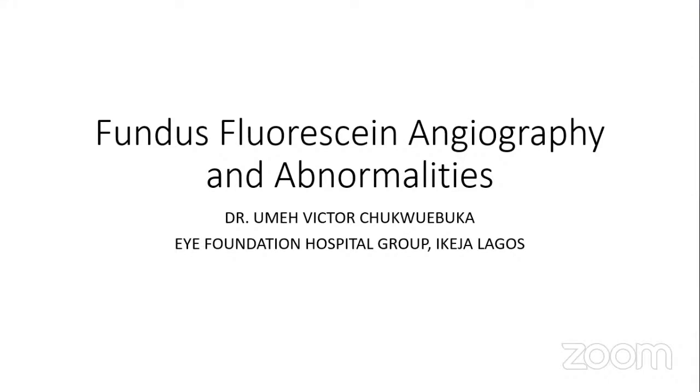This morning, we will do a short overview and proceed to tell us on hyperfluorescence and other abnormalities that can be found with doing fundus fluorescein angiography. Thank you very much, Dr. Ume. You can go ahead.